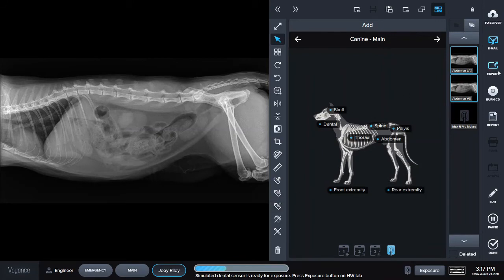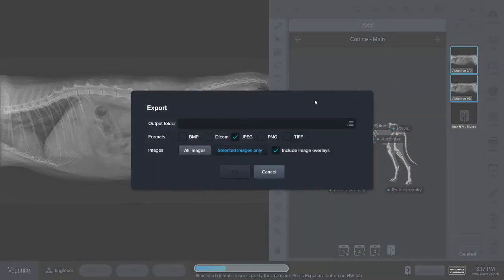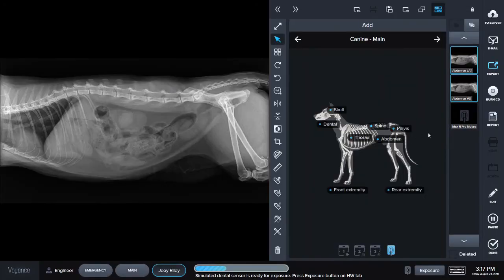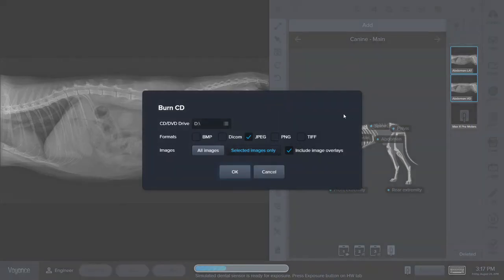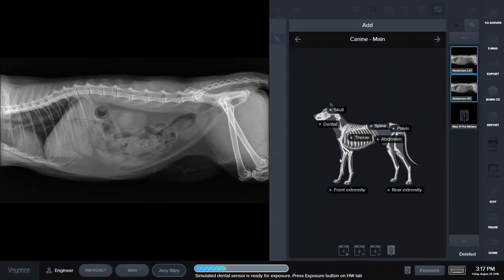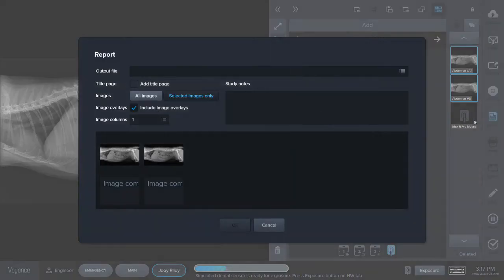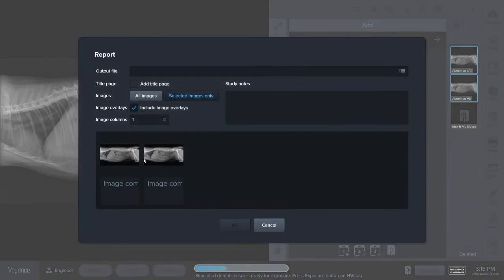You can also export the images and this will save them onto any files on your computer. You can burn a CD in any format that you'd like. Or you can create a report which will take the images — you can add any study notes in this section — and then save them onto your computer in a PDF format.